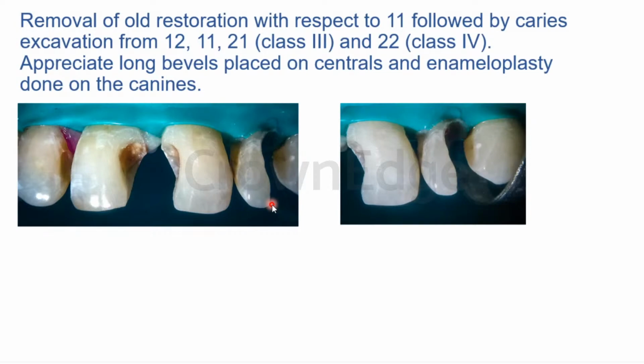Good. So this applicator tip is then scrubbed over the enamel and dentine for approximately 5 to 10 seconds or even a little bit more, after which you need to gently air dry, right? I want other guys to answer as well. Jaidev has been quite interactive. I want others to give your answers as to why we should gently air dry after applying the bonding agent.